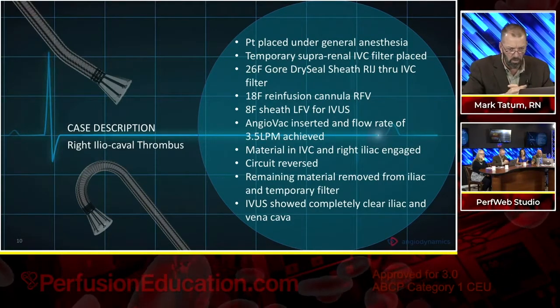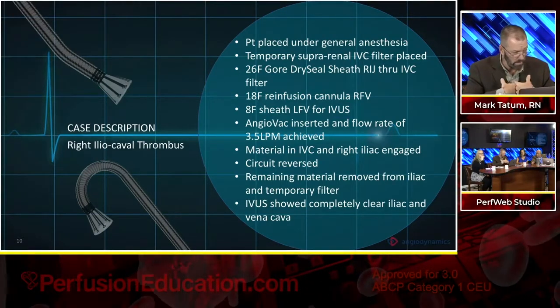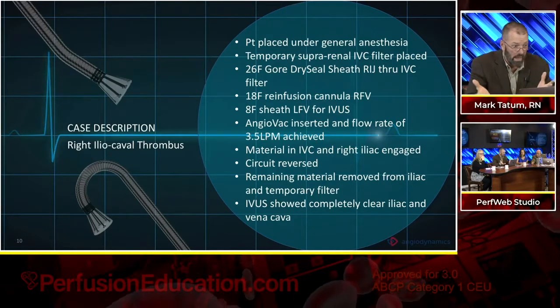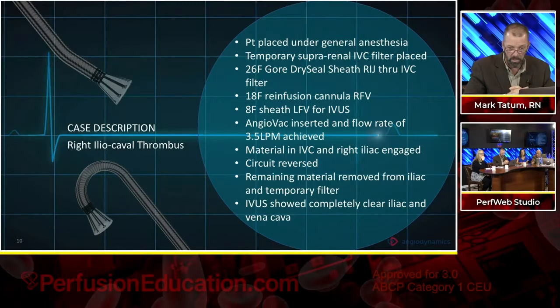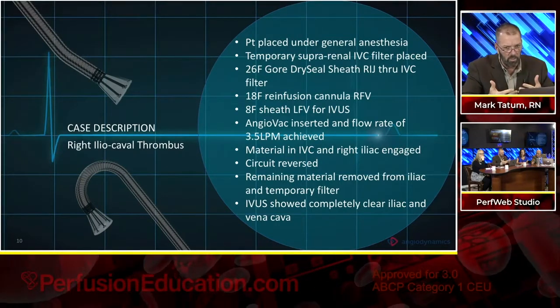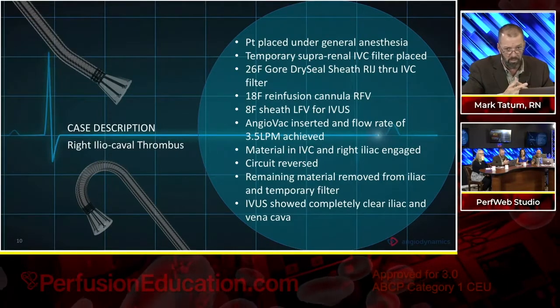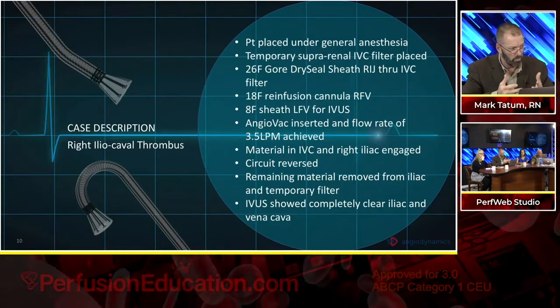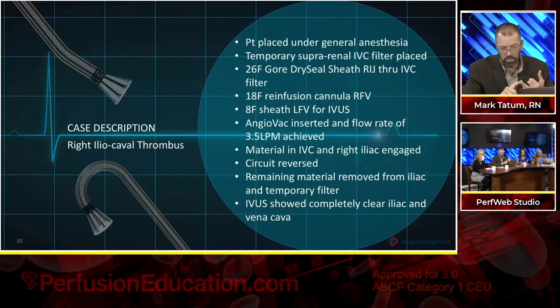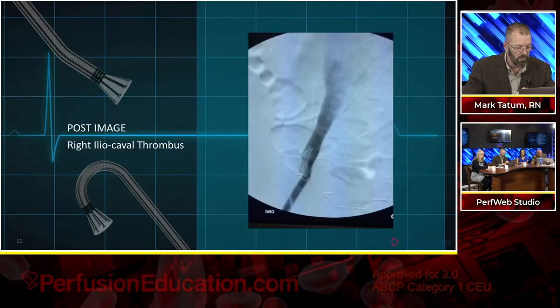So intravascular ultrasound is one of the things that we find used in these cases sometimes. Personally, I'm a huge fan. Less contrast is better. Less rads are better, so less gray is better. So you have the option to view live in real time exactly what the effect of your treatment strategy is going to be in the utilization of IVUS. And you don't sacrifice renal function or the exposure to significant amounts of radiation under fluoro when you're able to use that. So let's go to the next slide.